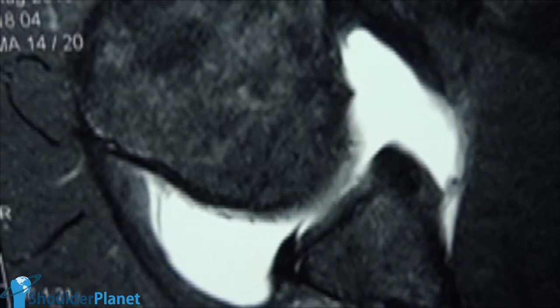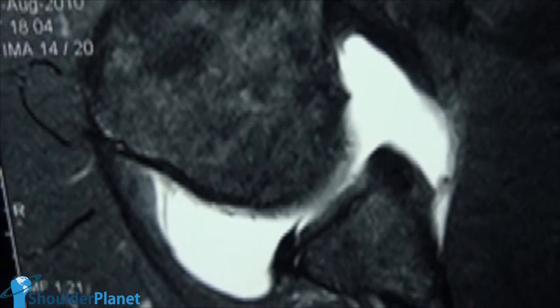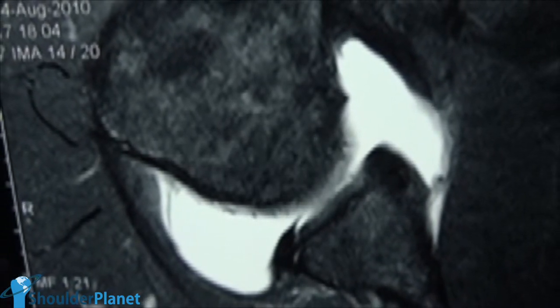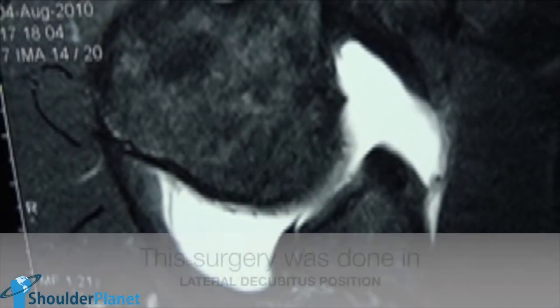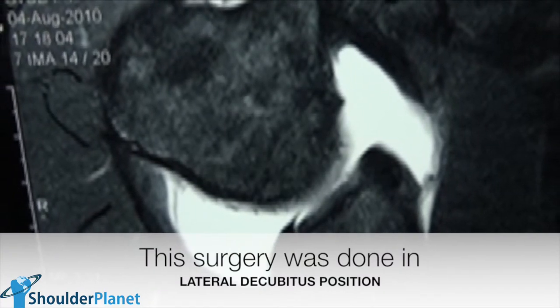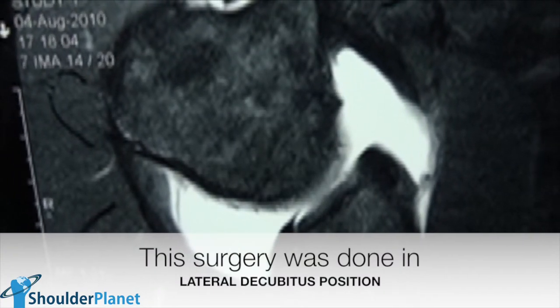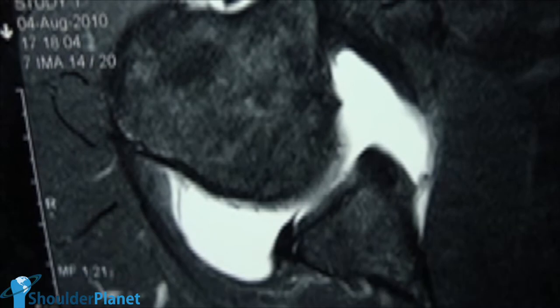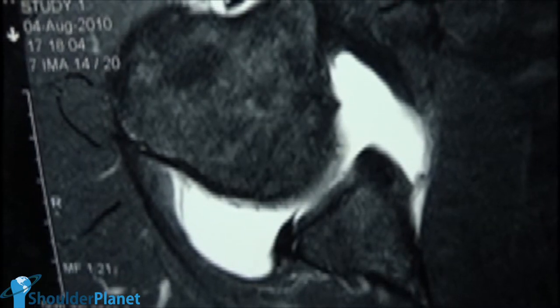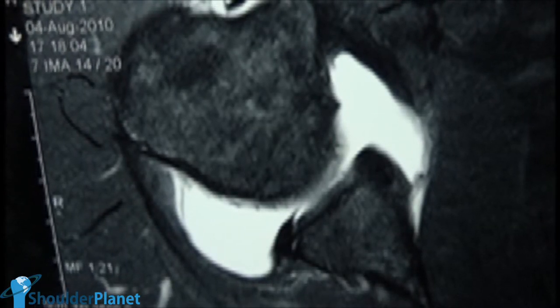It's important to say that I only do my shoulder arthroscopies in the beach chair position, but particularly in this case we used the lateral decubitus position. Anyway, this lesion was fixed arthroscopically, and so this is his arthroscopy.